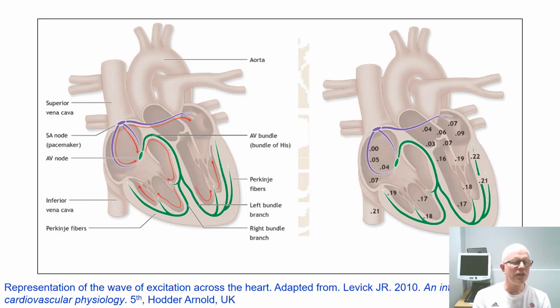So let's think a little bit about what the ECG is showing us. So let's dig inside the heart. And the two panels here are really showing us the same thing in many ways, but what they're depicting for us is this wave of excitation that I was referring to, and the key structures that are engaged as a result of this wave of excitation.